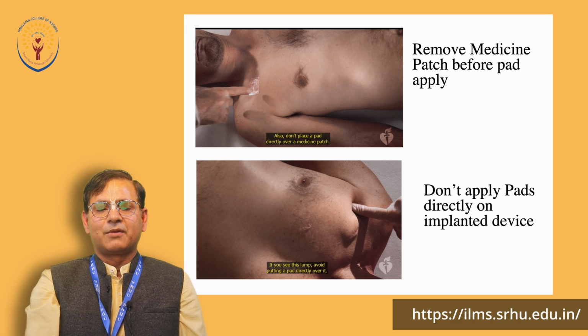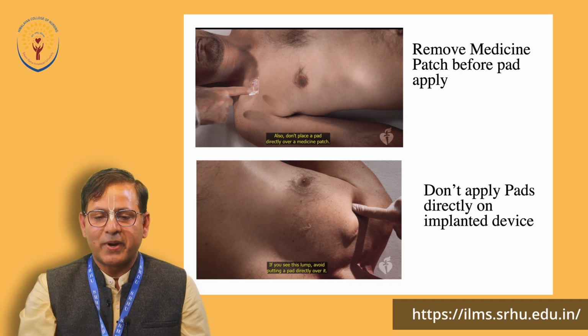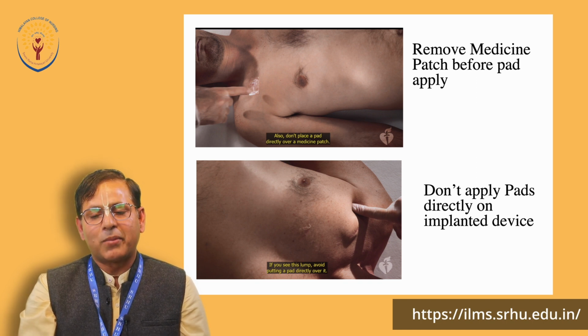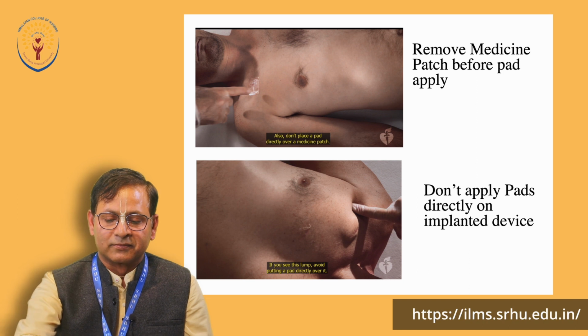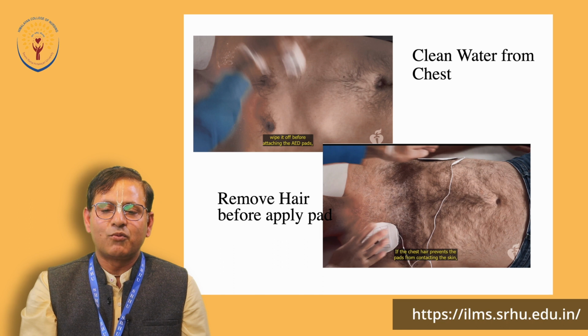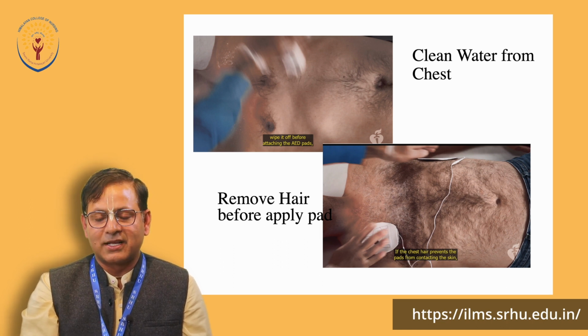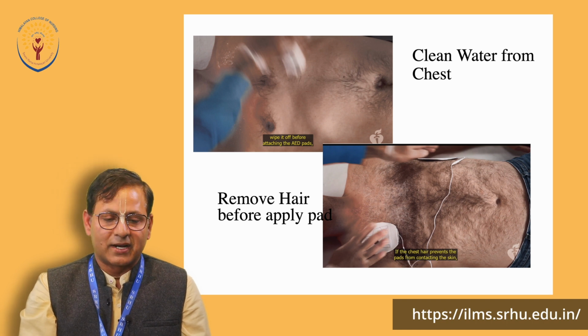Another condition: if any client has a medication patch on his chest, then remove this medicine patch before the pads are applied, and then we can go for the shock. Another condition: if any client has implanted devices on the chest, please do not apply pads directly on the implanted devices. Next condition: if any client has water on the chest, wipe it off before attaching the AED pads. So make it dry.